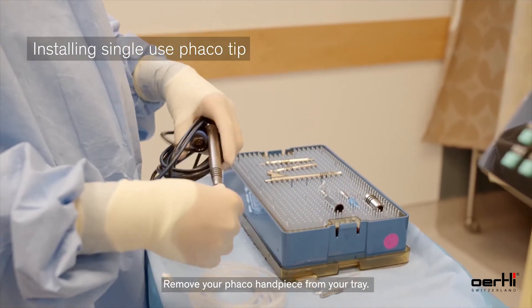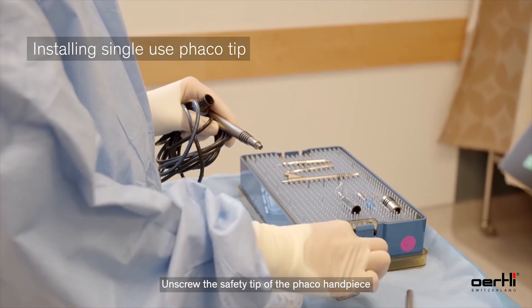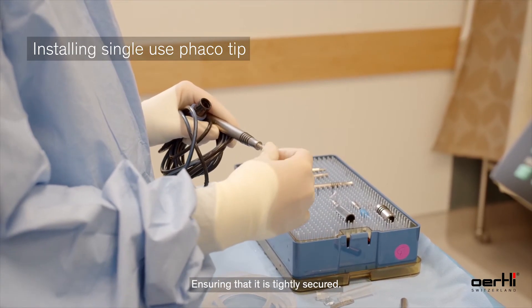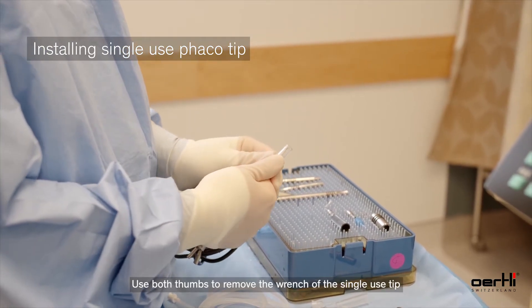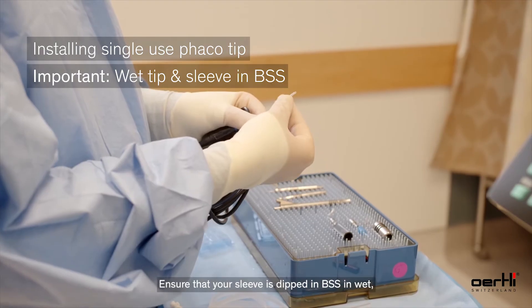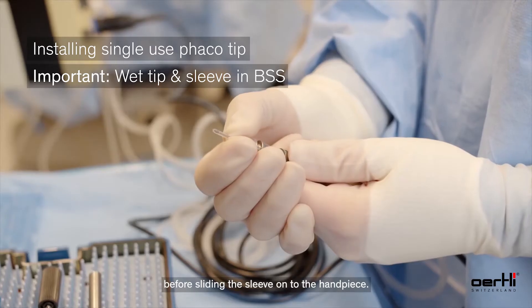Remove your FACO handpiece from your tray. Unscrew the safety tip of the FACO handpiece, then place your single-use tip on the handpiece, ensuring that it is tightly secured. Use both thumbs to remove the wrench of the single-use tip. Ensure that your sleeve is dipped in BSS and wet before sliding the sleeve onto the handpiece.